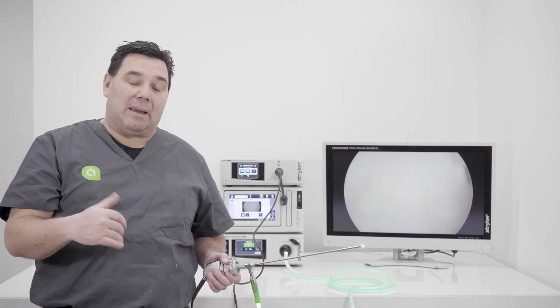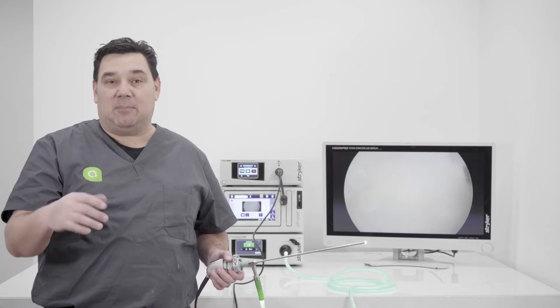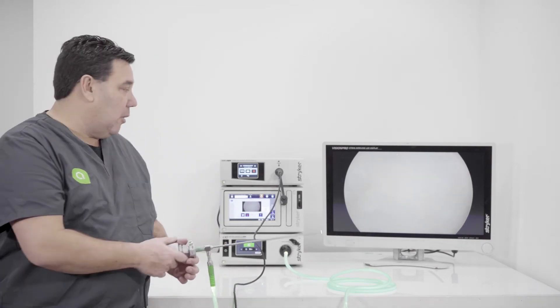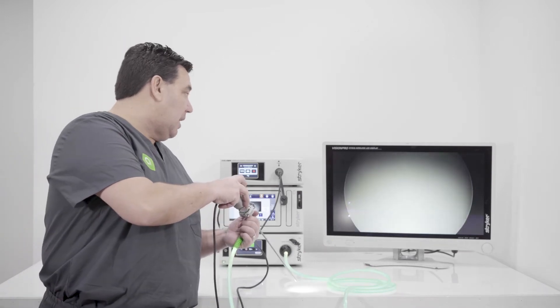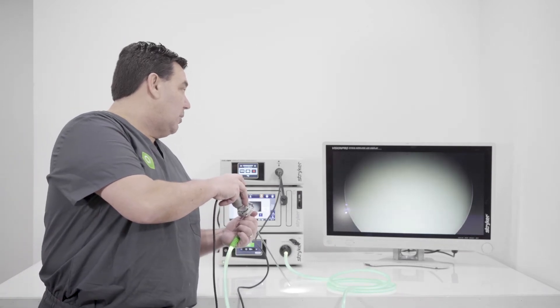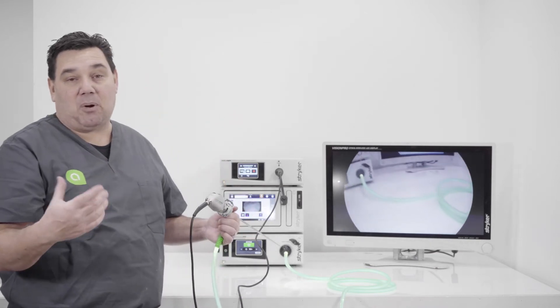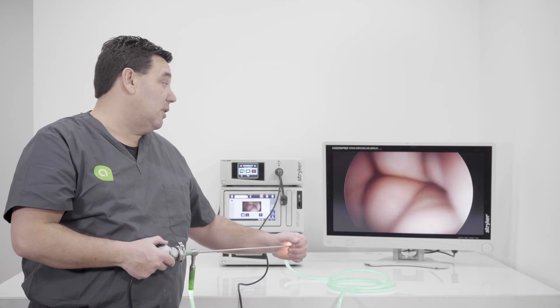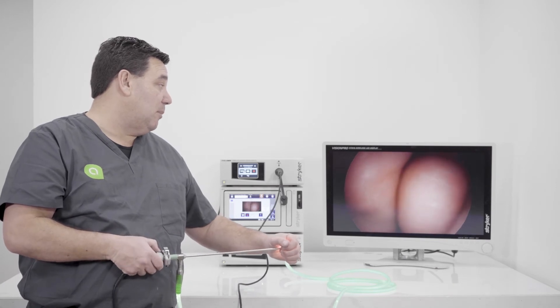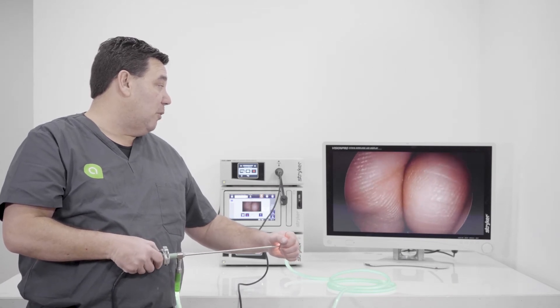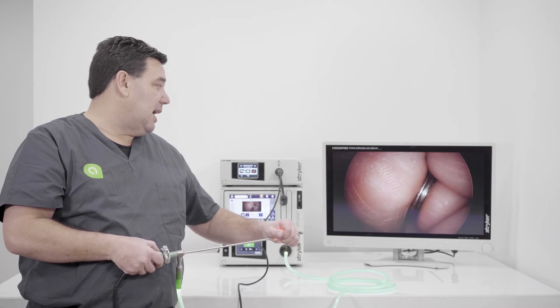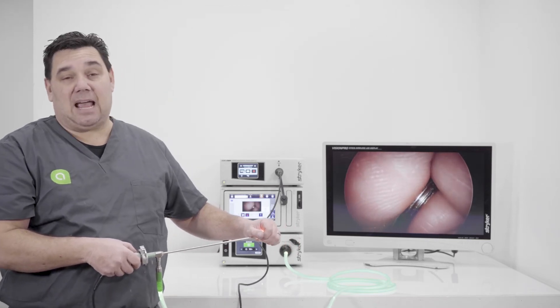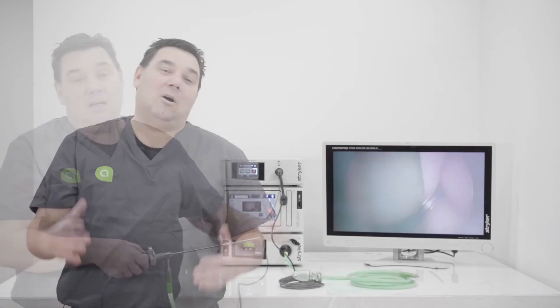But if you don't do a white balance, you'll definitely have some image color reproduction issues could occur. So basically what you want to do is you want to put it on something white, you want to push and hold the camera button W, and it'll let you know white balance in progress, white balance complete. Now your camera is white balanced. And with the camera being white balanced, we can now focus the image and it's almost like we're looking in the actual abdominal cavity.